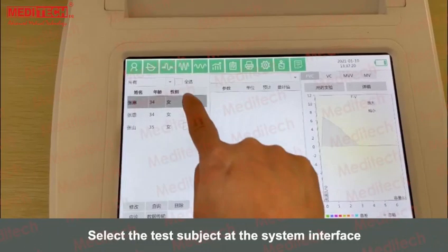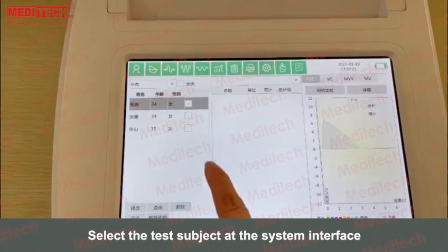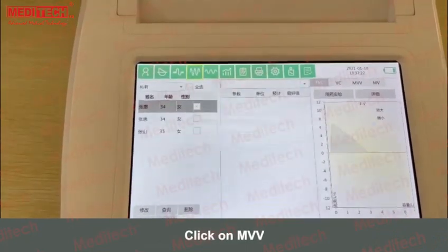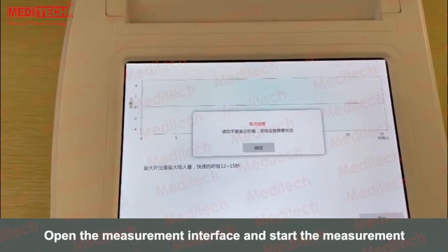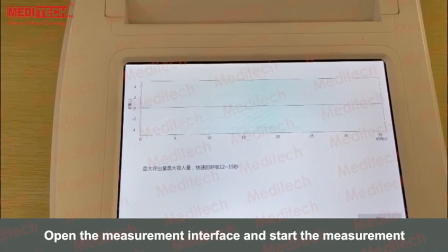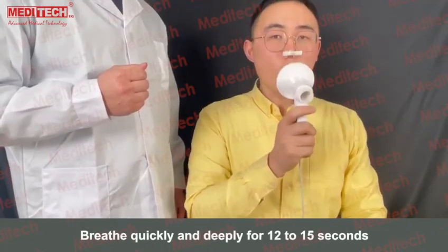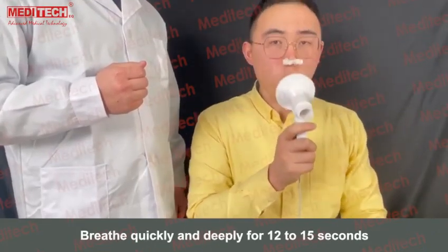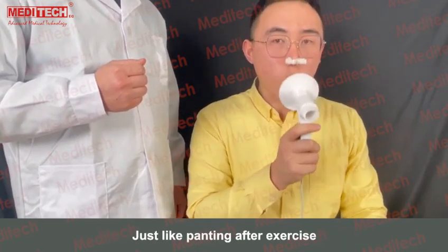Select the test subject at the system interface. Click on MVV. Open the measurement interface and start the measurement. Breathe quickly and deeply for 12 to 15 seconds, just like panting after exercise.